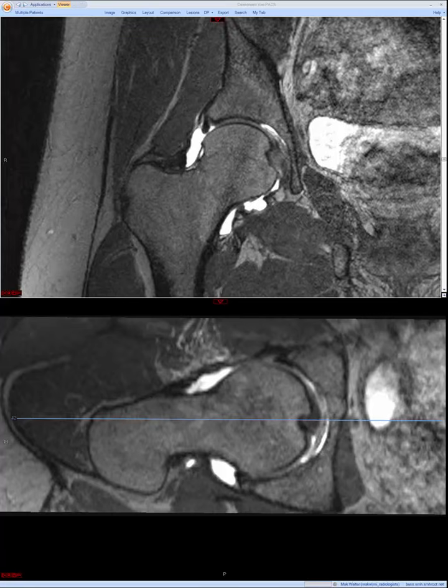I think a lot of it is dependent on what the clinical question is, because parameters, particularly field of view, become very important. We want a focused, smaller field of view if it's a dedicated labral assessment or cartilage assessment. For example, if the query is to assess for features of femoroacetabular impingement.